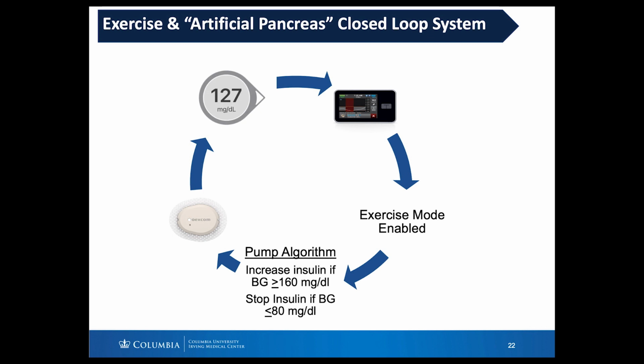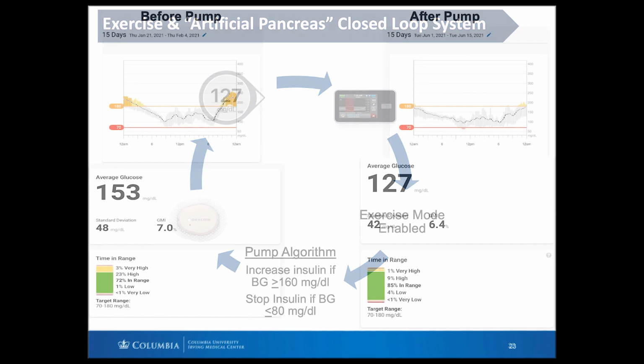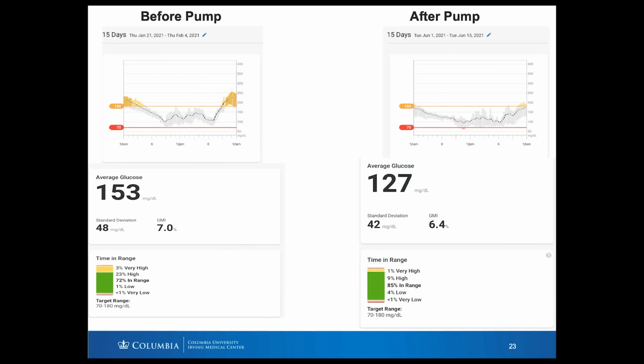And just to give you a feel of the difference between multi-daily injections versus using an insulin pump, this is from when I was first diagnosed, using a continuous glucose monitor. I was actually the person that trended upward at night. Usually most people trend downward. But I kept doing shots at night, and if we remember going back to time in range, I'm roughly at 70%, which is borderline.